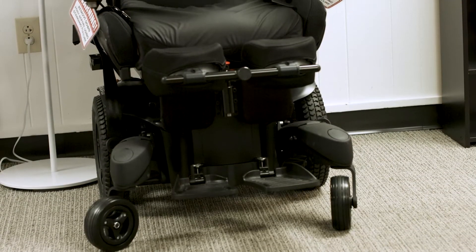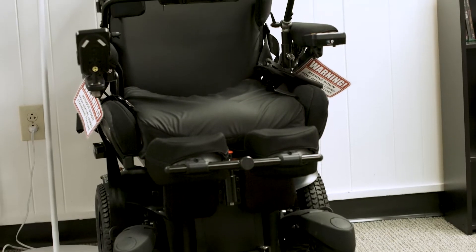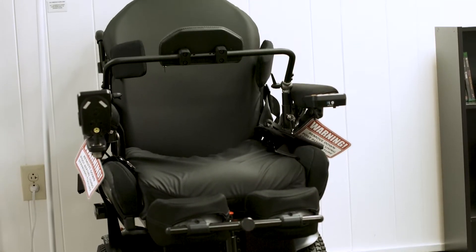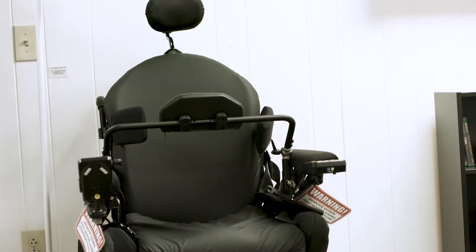I'm here to tell you about our standing wheelchair that we have in the CLE. Our model is called the Quickie 700 Up. There are plenty of other models out there, but I'm going to show you the features of the one that we have here.